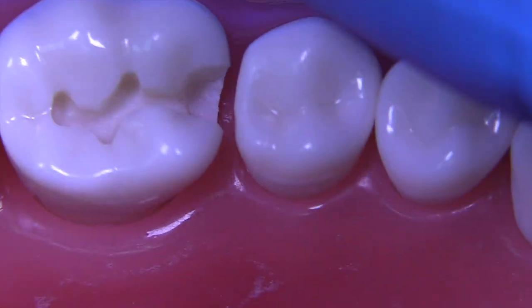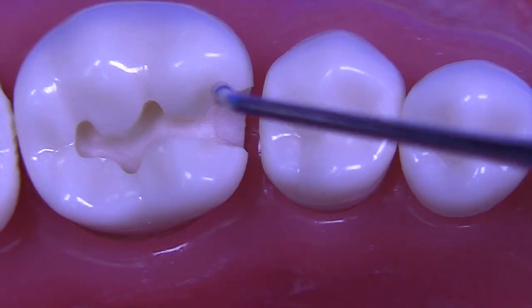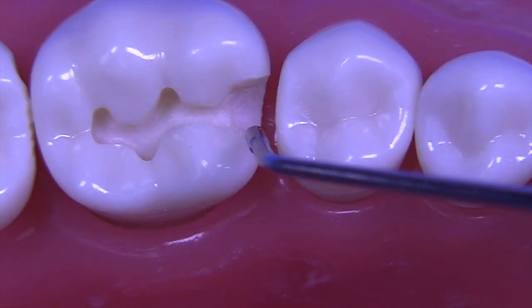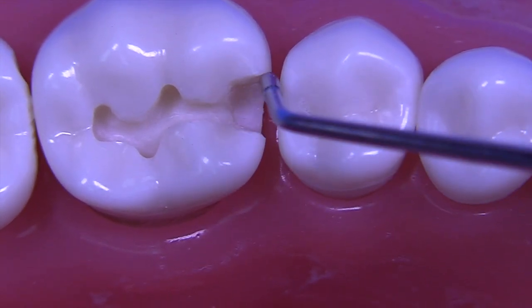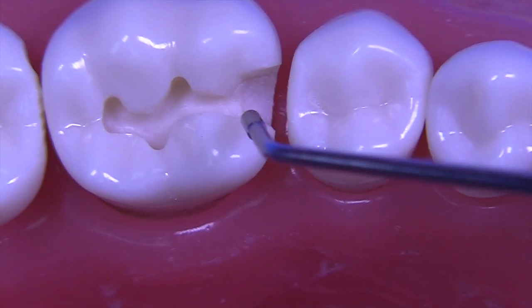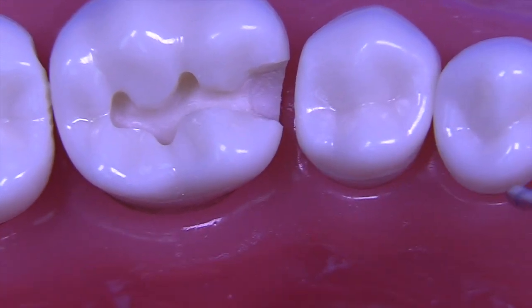And we like to try to have that wall somewhat convex in most situations, or at the very least straight and uniform and parallel to the outer cavosurface margin at the gingival. And in this particular case, you can see that it's angled just a little bit.